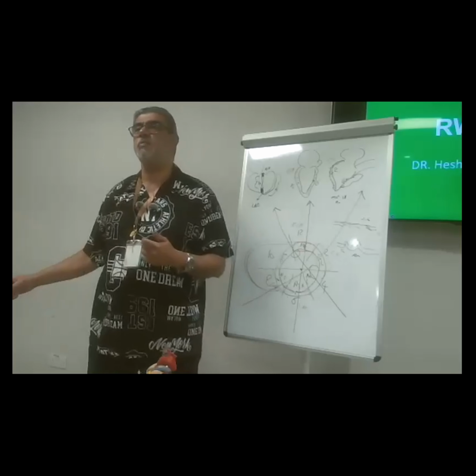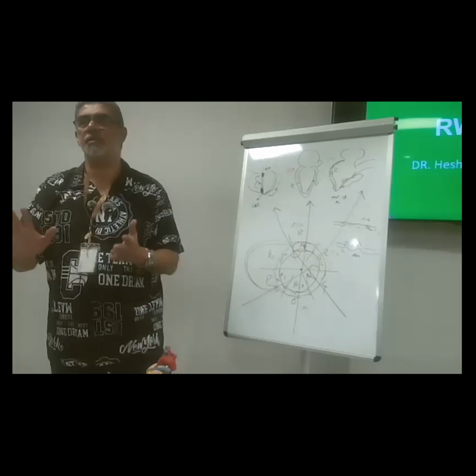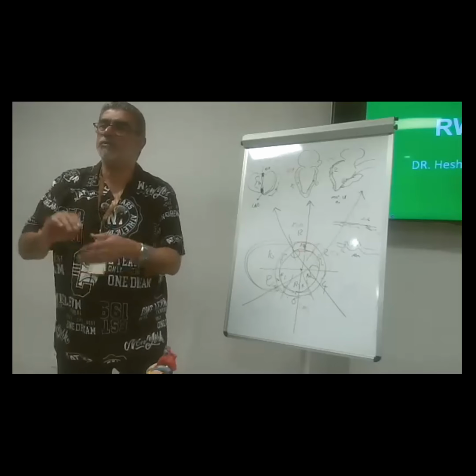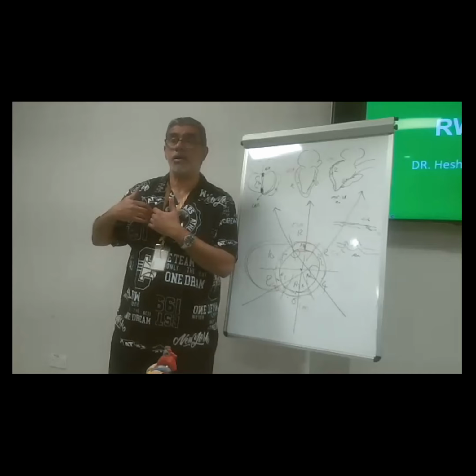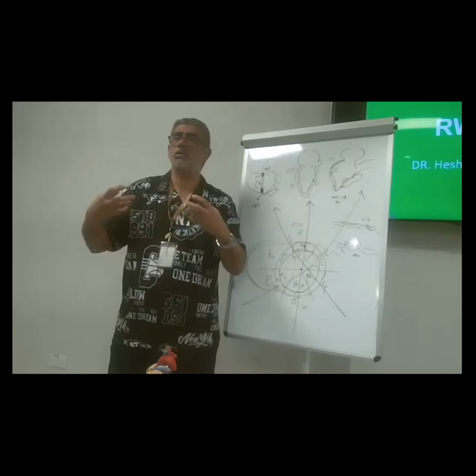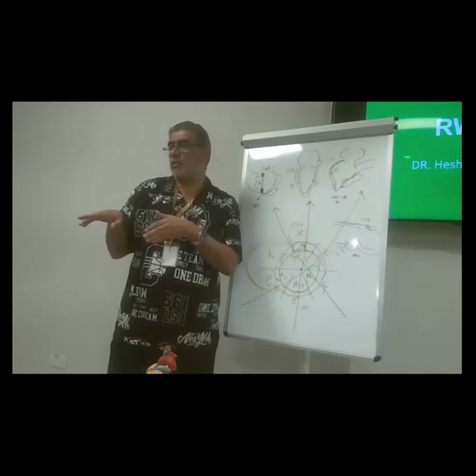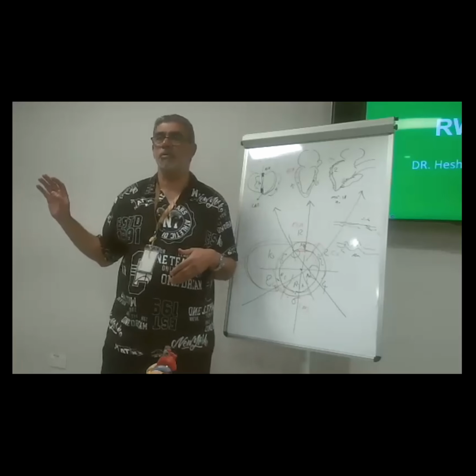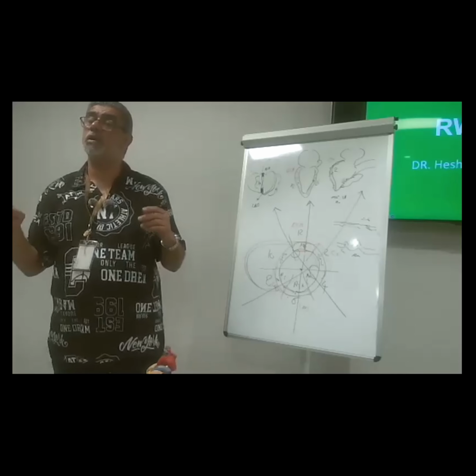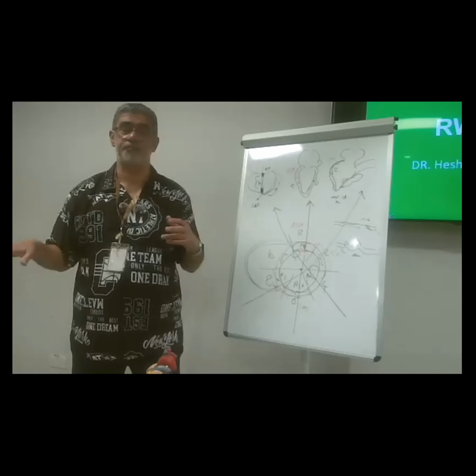This week, I spent 20 to 30 minutes doing deaeration. Deaeration is very important. So air can do it. What is the treatment? You will just increase the pressure to allow the air to go more distally until it is spontaneously absorbed. Air is really common. You can see this.